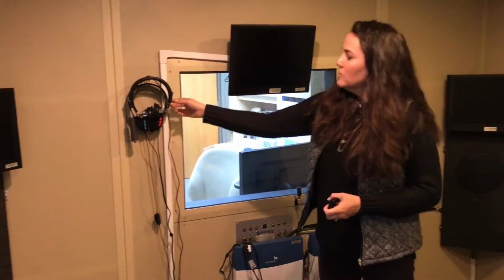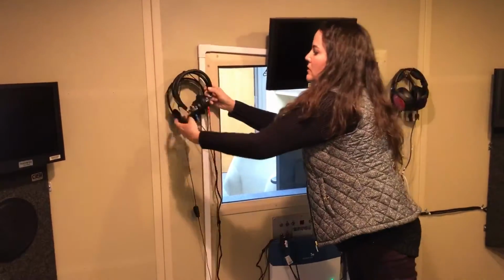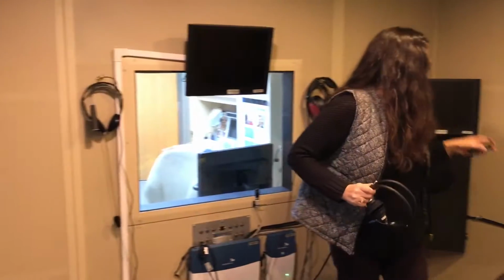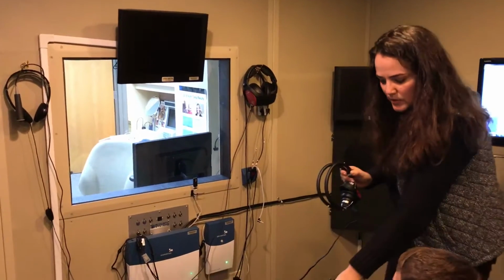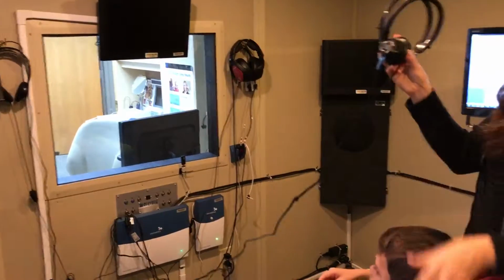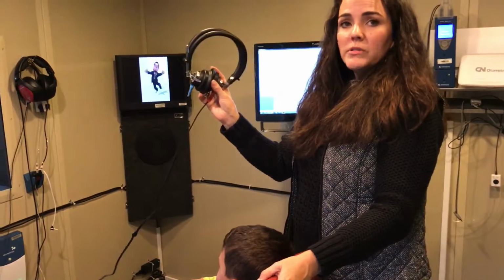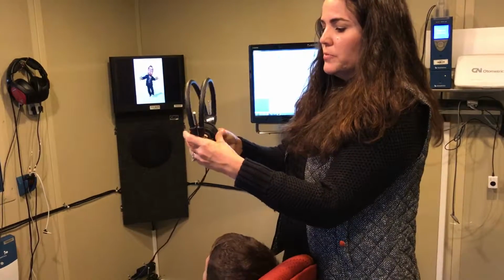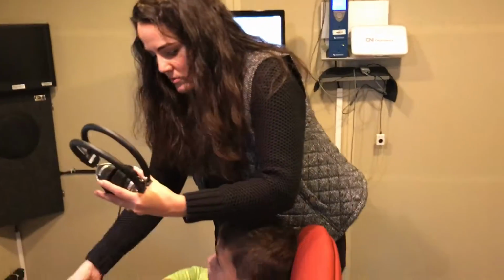And then we also have traditional headphones. I see something. Hold this. So if you don't want to use insert earphones, or if you're doing a screening, we're always going to use this type of headphone for a screening because you're not in a sound treated room. These are better at isolating sounds.